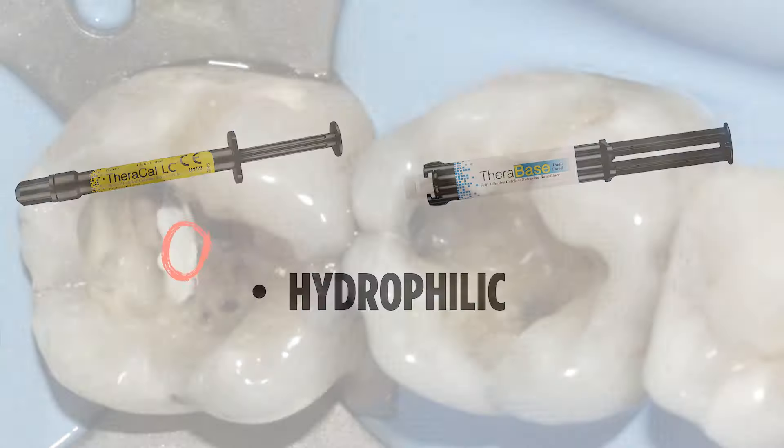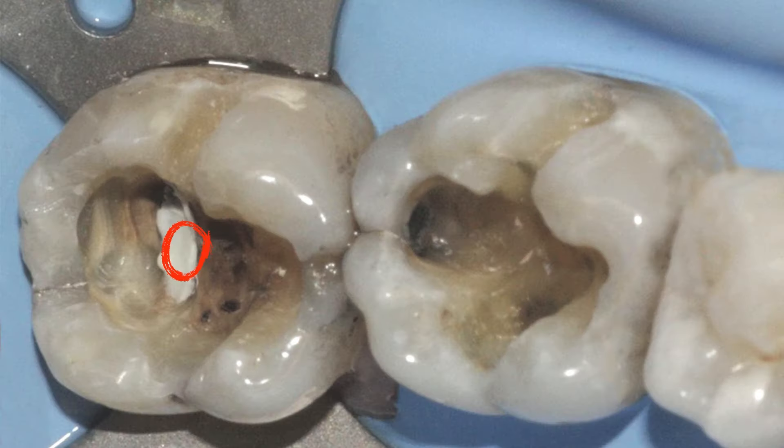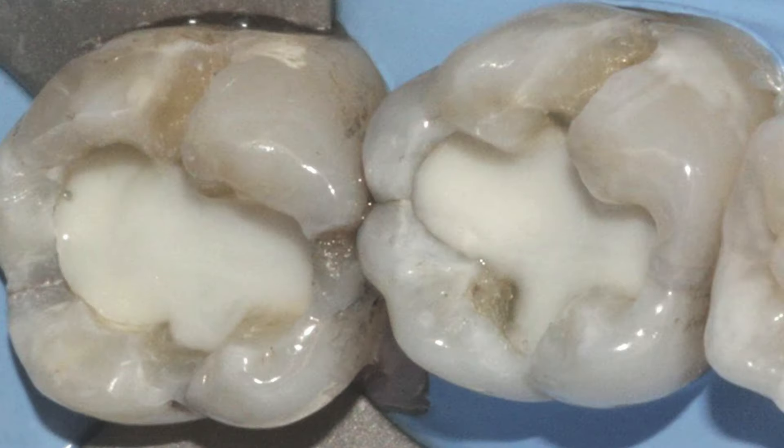Let's look at a case. This tooth has been prepared and the pulp is visible, so we're going to place a one-millimeter increment of TheraCal on top of the pulp, then light cure it. Then we're going to place the TheraBase and light cure it.